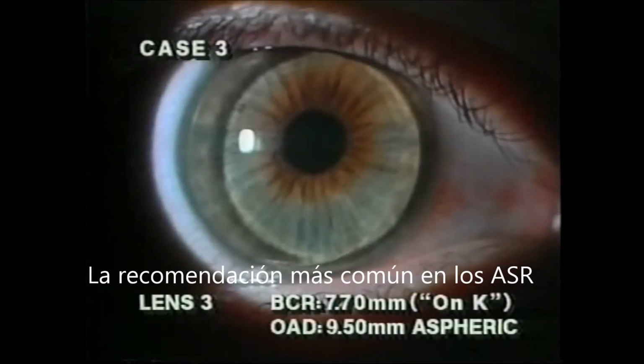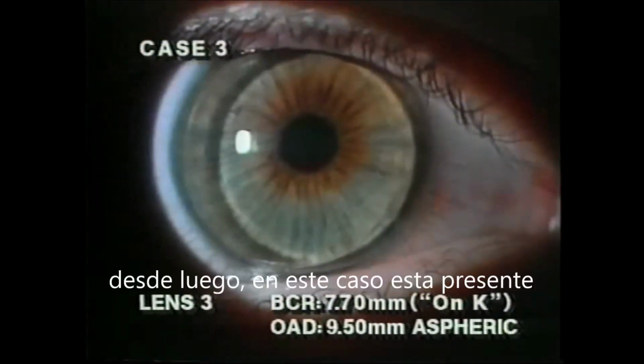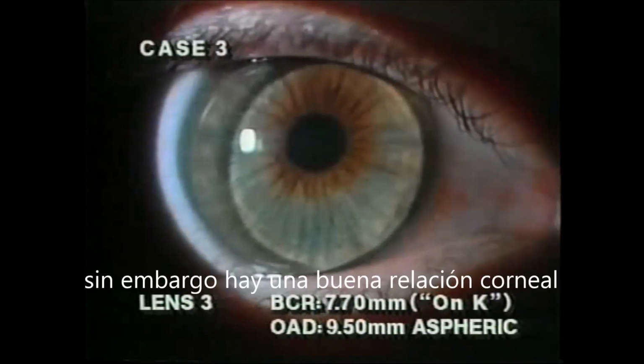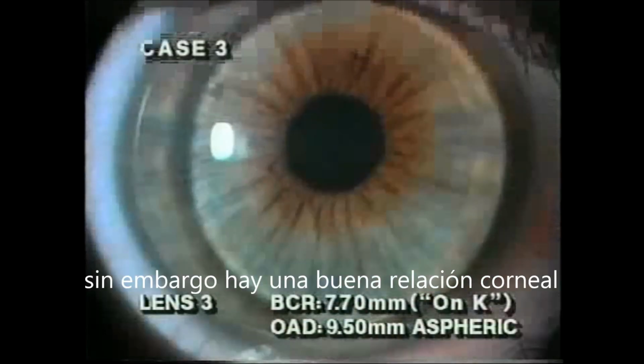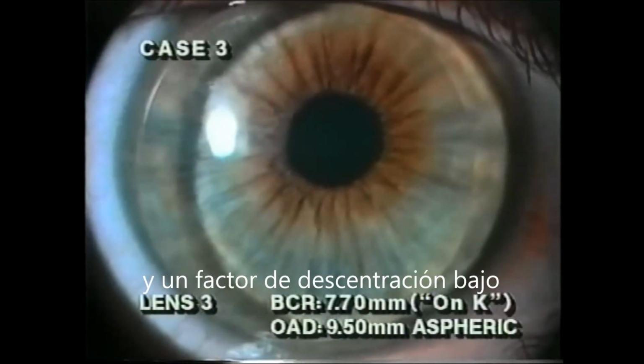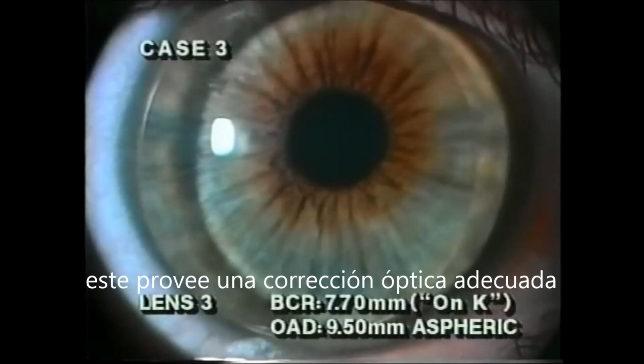Our final lens in Case 3 features a progressive aspheric design. Although slight inferior temporal decentration is present, a much improved lens to cornea fitting relationship can be observed. This lens design has a large diameter and a low eccentricity value, or rate of flattening, to better contour the cornea. It provides distance vision correction only.